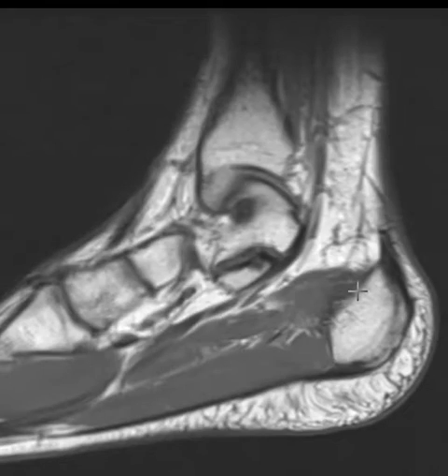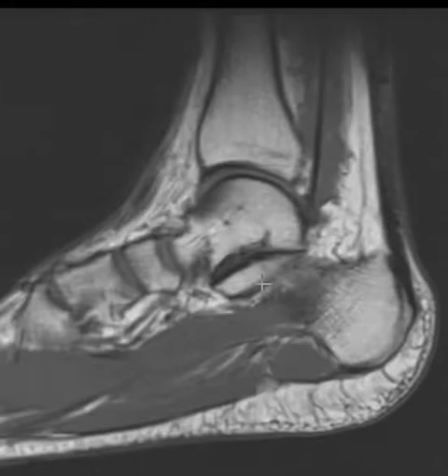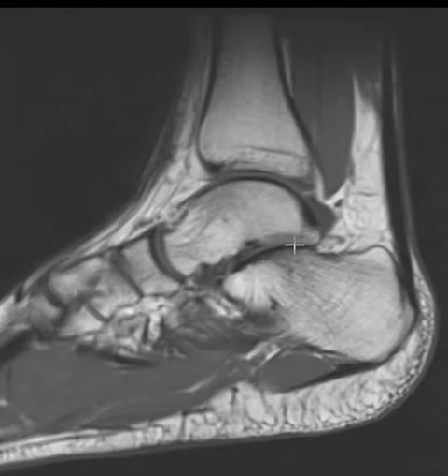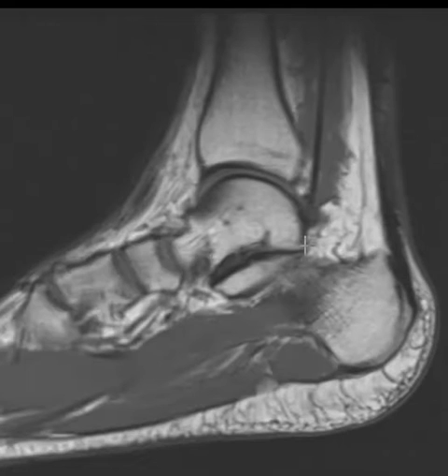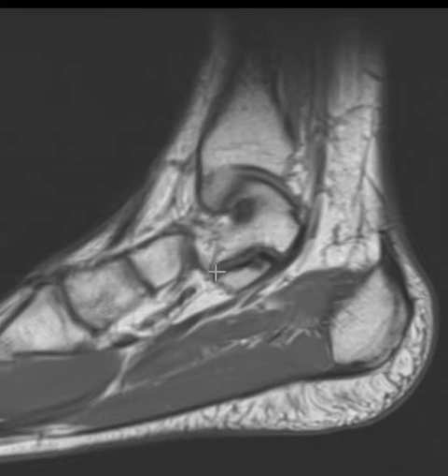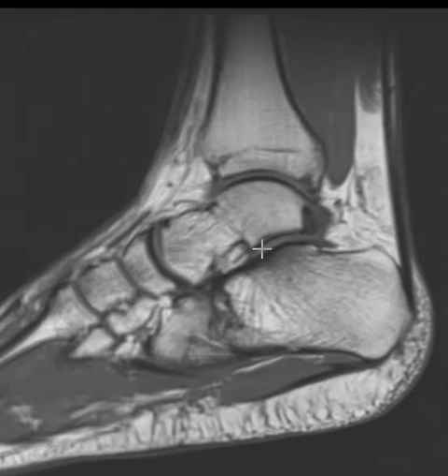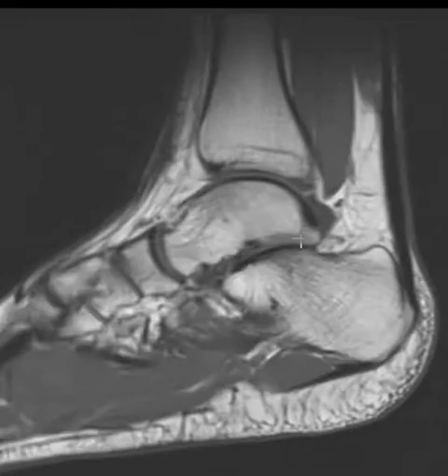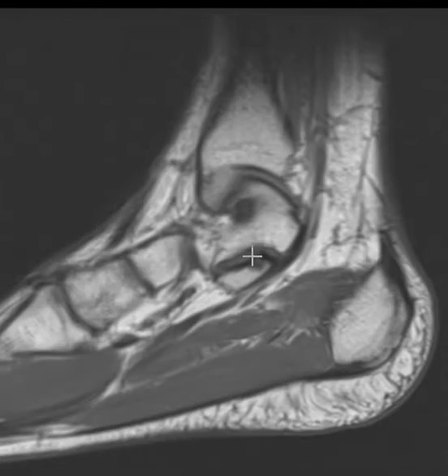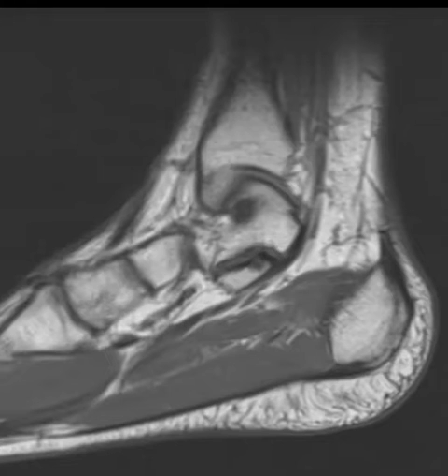Now we're going to go along the medial side, and on the medial side things look a little funny in here. Normally we have a joint in the back here called the posterior subtalar joint, and another joint here called the middle subtalar joint. It looks like those two are continuous, like one big joint — the posterior and middle — and there's something here between them that looks like it bridges.